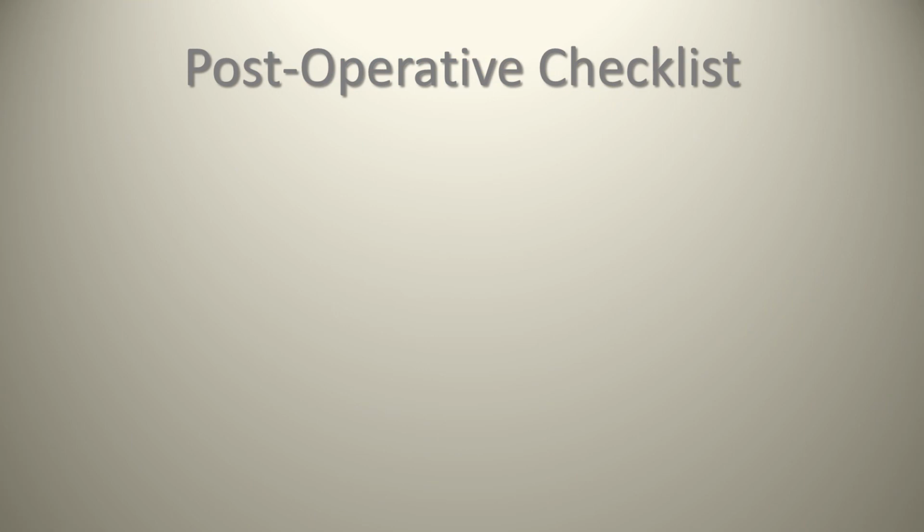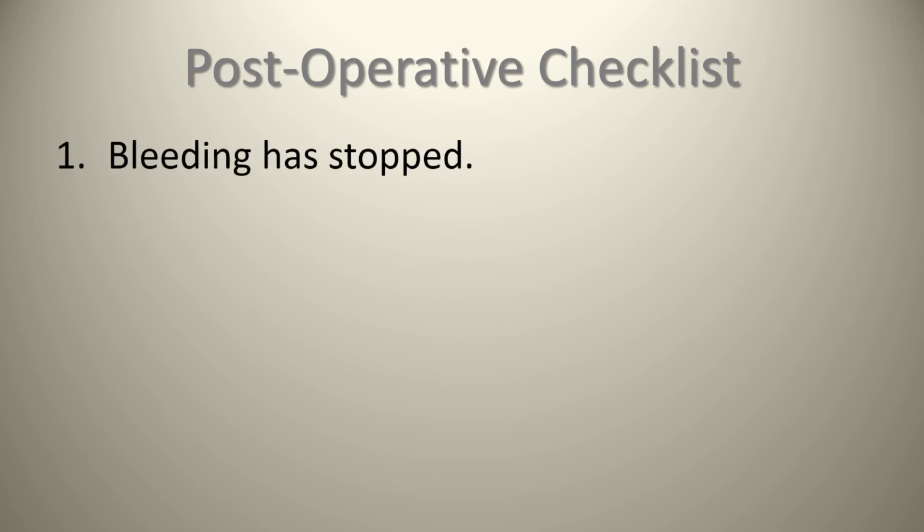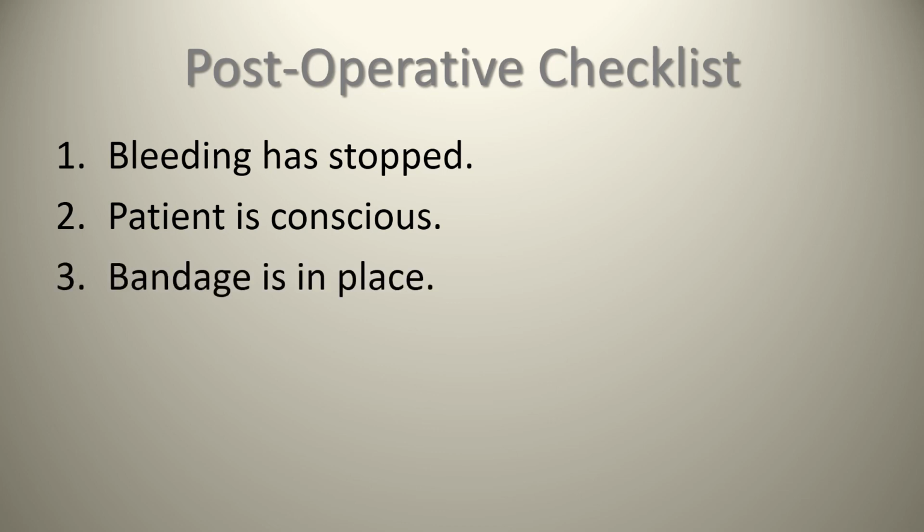Checklist. Once again, after obtaining your samples, you want to make sure that bleeding has stopped. As we previously noticed here, you want to ensure the patient has a piece of gauze to apply to the area. Many times, once the needle has gone in and taken a venipuncture sample, normal practice is to take the tourniquet off first, and then apply the gauze and remove the needle. In this video, it's done a bit backwards, applying the gauze and drawing my needle first, and popping the tourniquet off.